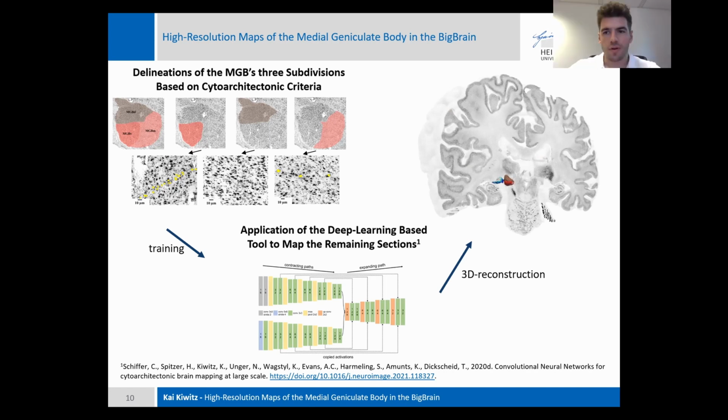I could also agree that upscaling in some sense, and maybe going to 1 micron or even sub-micron resolutions for the BigBrain, many would benefit from that. And even though we don't have, correct me if I'm wrong, any more sections that can be rescanned at higher resolutions. Is that right, Alan?